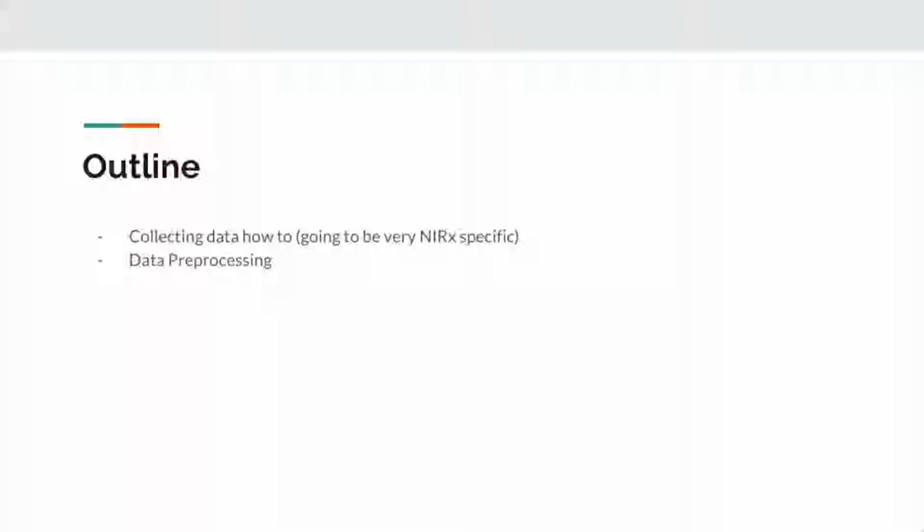And hopefully there's some stuff in here like troubleshooting tips for people who have been doing data collection that might not know everything going on. This is everything that I know, but if other people also have like, hey, we did this and it worked, shout it out. This stuff is also going to be very NIRx specific, obviously, because that's the system we're working with. So if you were at some point to work with a different NIRS system, the principles might still be similar, but the exact way it's done is going to be very different.